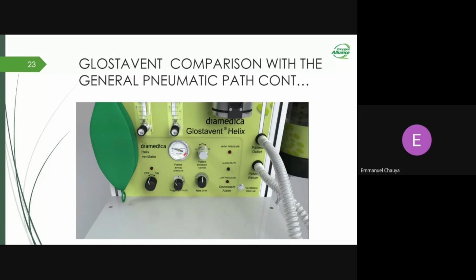Breaths per minute. Here you control how often, and how slow or how fast, the bellows should be going up and down, thereby also controlling the breath rate of your patient. And just up this knob, you have the patient pressure control. When you are rotating this clockwise or anti-clockwise, you'll be adjusting the pressure, and you can see it in real time on the pressure gauge.